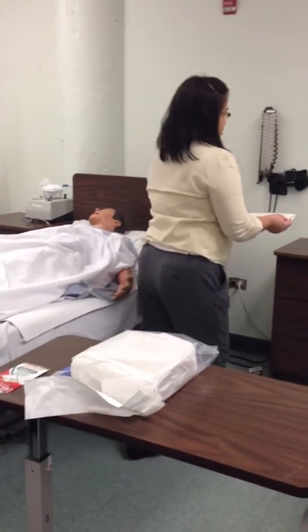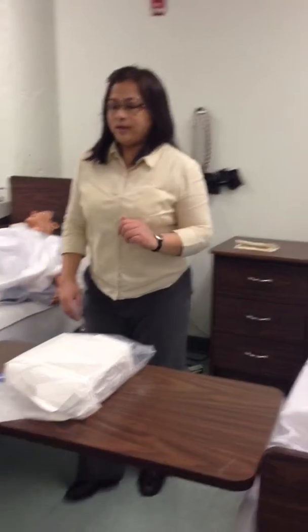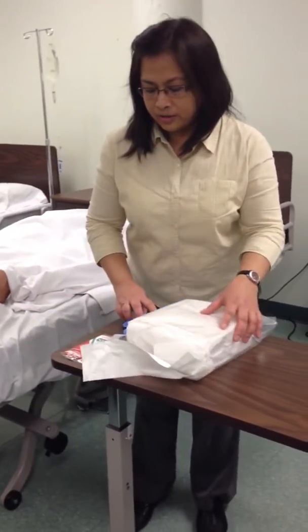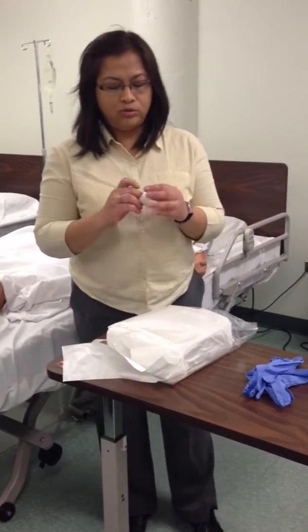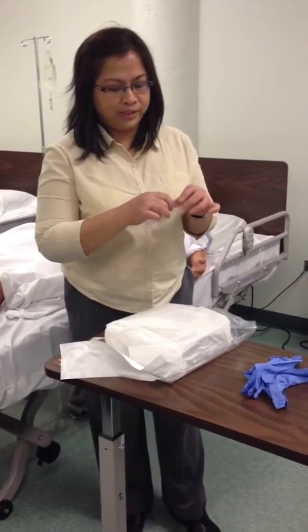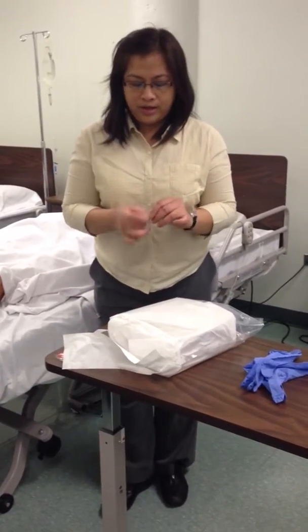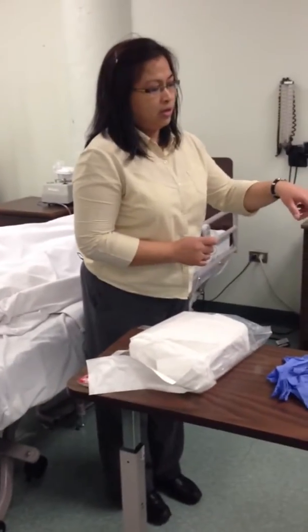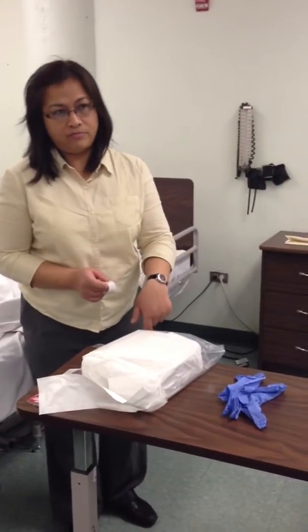So this sterile glove has to be over here, and this one is here. All right, so you're going to prepare 2 short tapes. If you're going to use tape to secure the catheter, you need to prepare it right now.